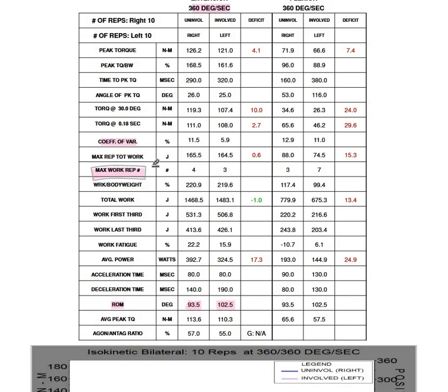The max work repetition being anything higher than repetition 2, really the second repetition performed, and an inconsistent range of motion between tests, are hallmarks that perhaps a more thorough familiarization period was needed, or perhaps more time taken with the trial repetitions was potentially needed.